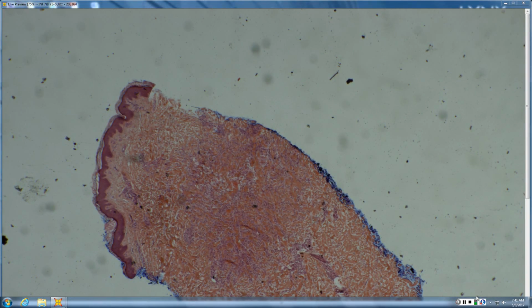In this case, NLD is top to bottom, side to side. GA is focal and patchy. GA has degeneration of collagen with replacement by mucin, and you can see the space between the collagen bundles. Well done.